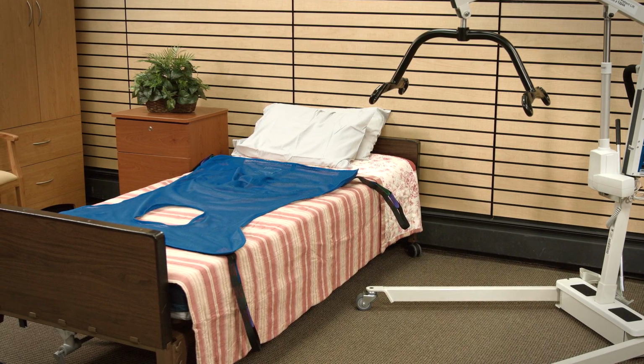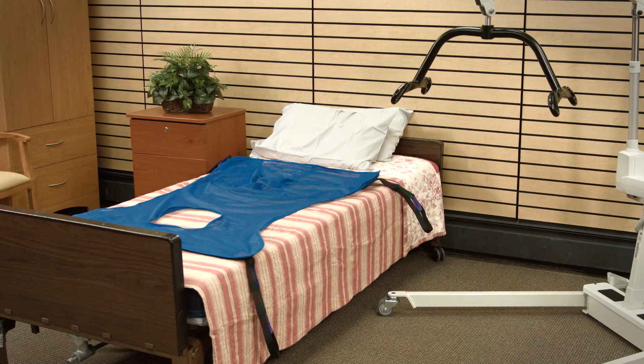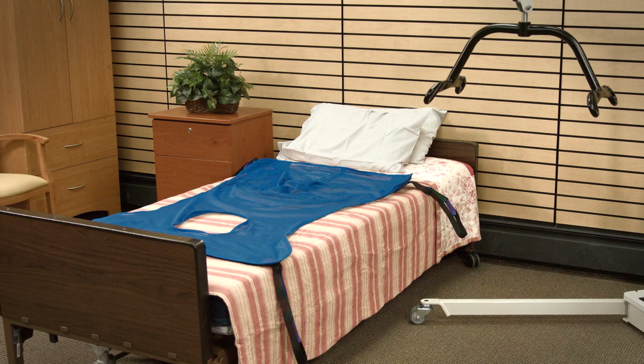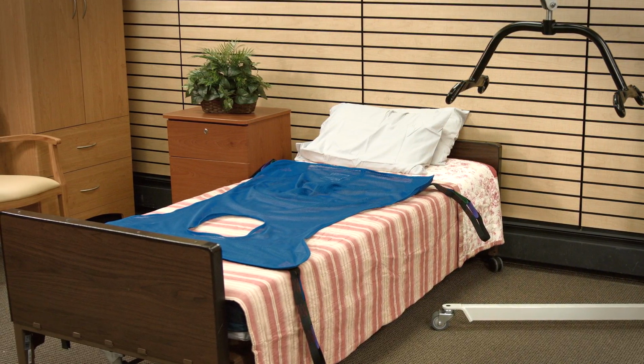Safe transfers begin with a patient sling that is not worn, has no loose stitching, and is not frayed, torn, broken, or excessively washed and bleached. Broken slings are unsafe. If the sling appears to be unsafe, do not use.